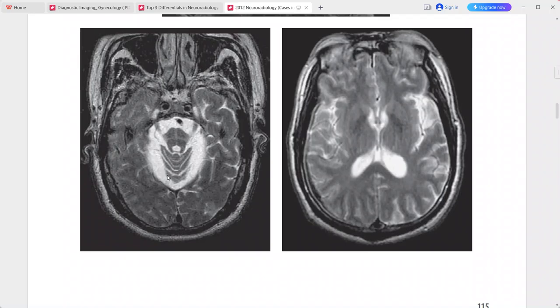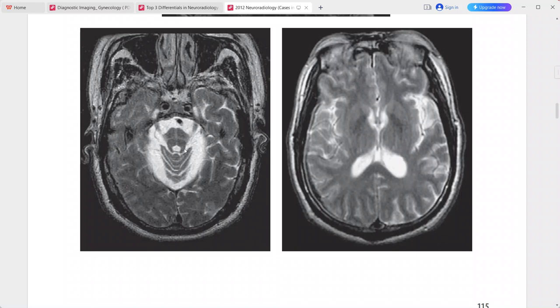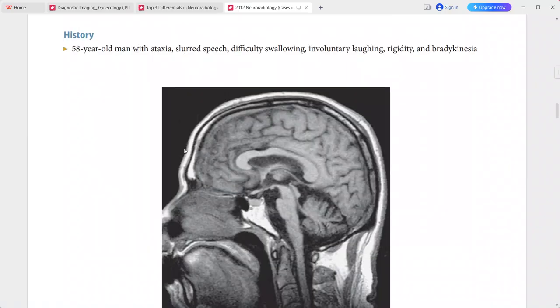T2-weighted images show coronally and sagittally oriented bands of hyperintense signal in the pons, along with subtle hyperintense signal along the lateral margin of the putamen. This is the typical 'hot cross bun sign' of multiple system atrophy (MSA).